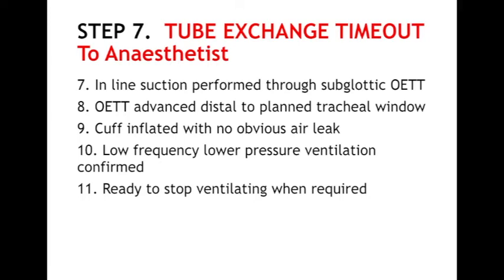The cuff remains inflated with no obvious air leak, that the low frequency, low pressure ventilation is confirmed, and that the anaesthetists are ready to stop ventilating when required. Because many of these patients are sensitive to prolonged periods of hypoventilation, the ventilation is not actually stopped until tube exchange is required, and the initial tracheal incision is performed with the ventilation still running.